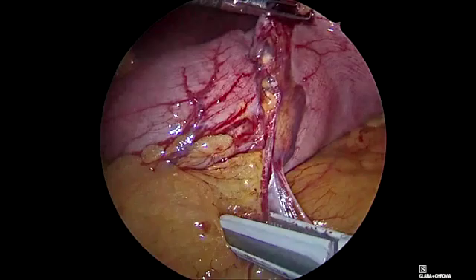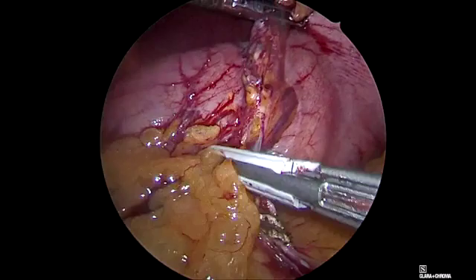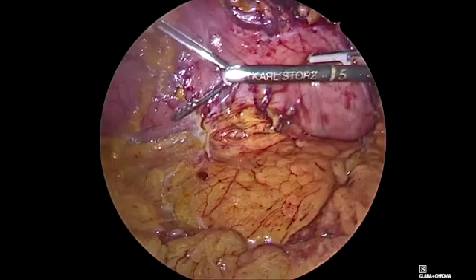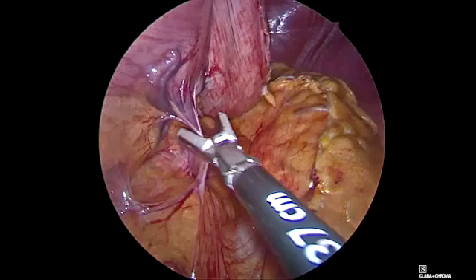We try to use this double ligation throughout all this process so that we will not see a significant amount of blood. It is also nice to release this posterior adherence that might be in our way during the stapling.